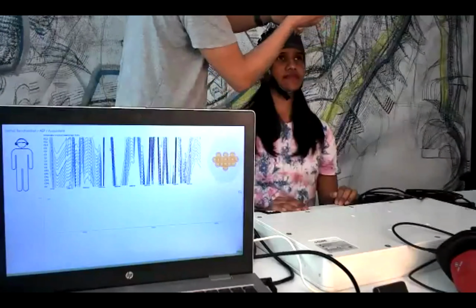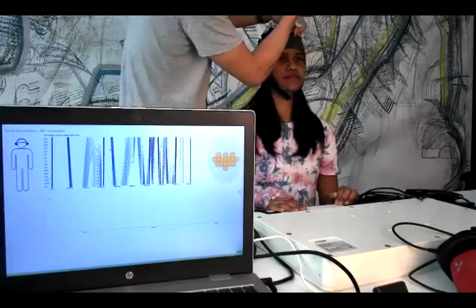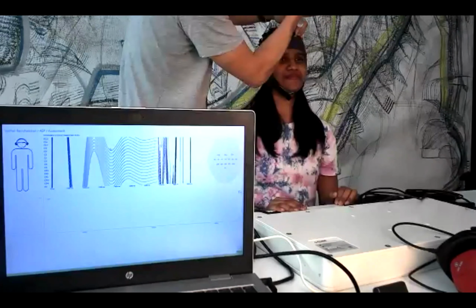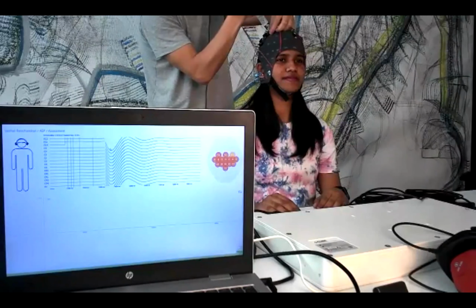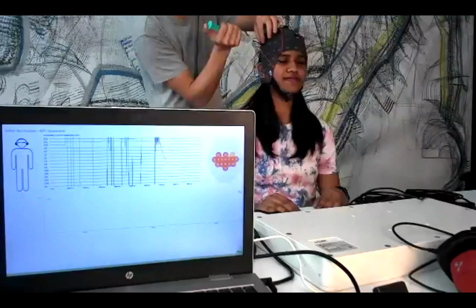Vaishali also had this very nice experience with mindBEAGLE. Last winter, actually, she brought the mindBEAGLE system to India. I think that was the first mindBEAGLE assessment in India, I guess. So she also got very good results from the patients.